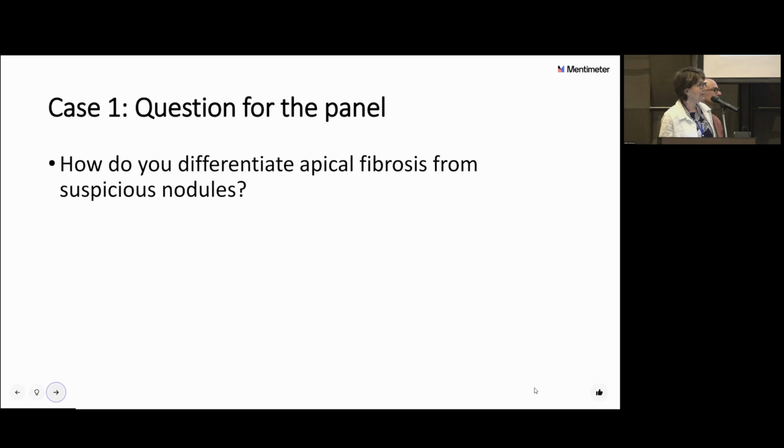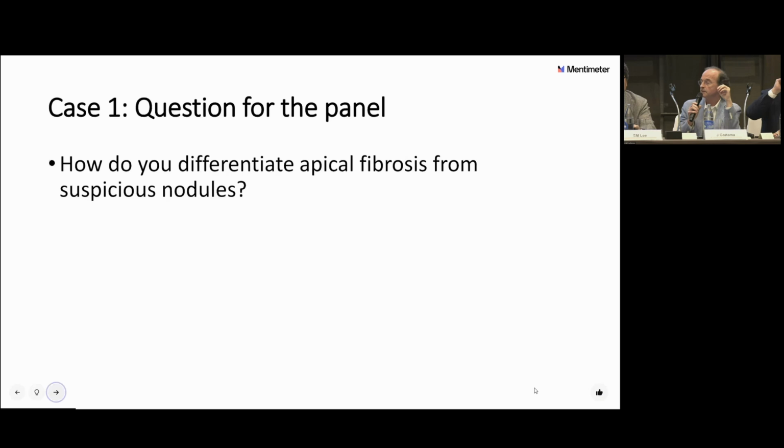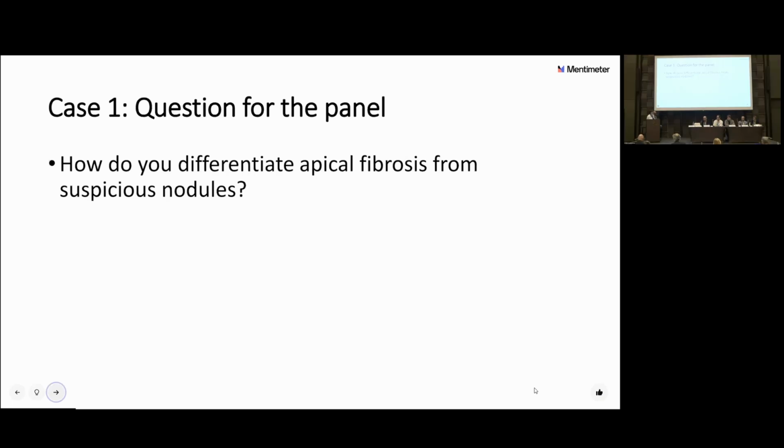So who would like to start? Shall I start? Yes, please. For apical scarring, usually it's relatively symmetrical, and it's in the apical parts of the lungs. We now only have one image, but of course in the scan you can look coronally for more symmetrical scarring. It could be a little bit asymmetric. And this one is a little bit of an atypical location for scarring, and also because of its aspect. Usually you can see it coming down from the apex, and it's relatively smoothly bounded. So then you can think of a lymph node, but it does not have the characteristics of a lymph node. You would also not expect it in the correct location, right? Because the lymph nodes are usually in the bottom of the lung.